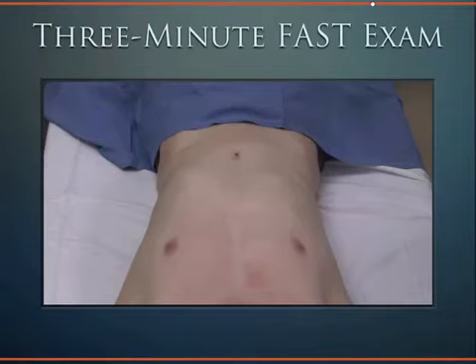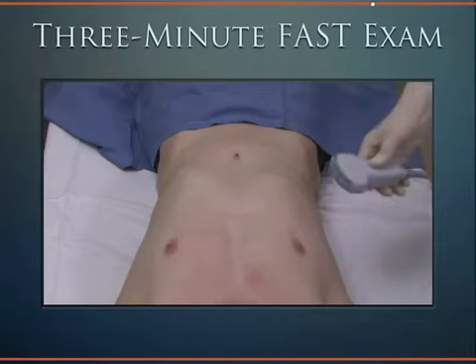The FAST exam has four major windows. The first window of the FAST exam is Morrison's pouch.